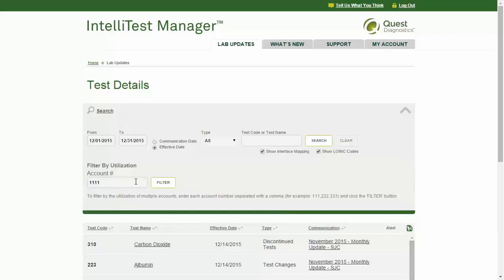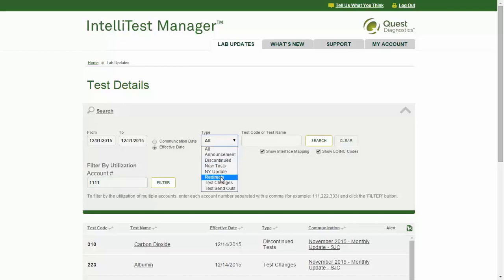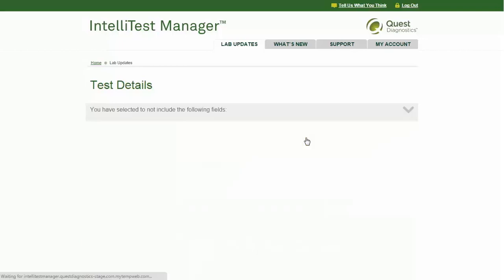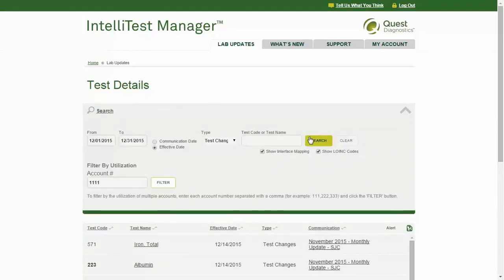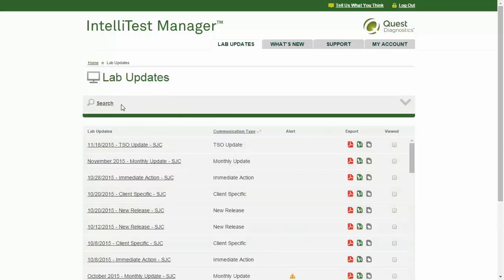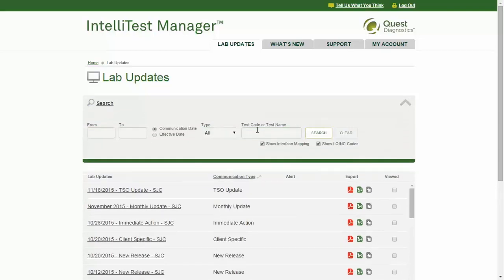To filter by additional account numbers, type them into the account number field separated by commas. You may use the other search fields in conjunction with a date range or without one. For instance, if you are interested in all communications of a particular type within a date range, select the type and click Search. Or, if you want to locate a communication regarding a particular test, clear all other fields, then type only the test code or test name and click Search.